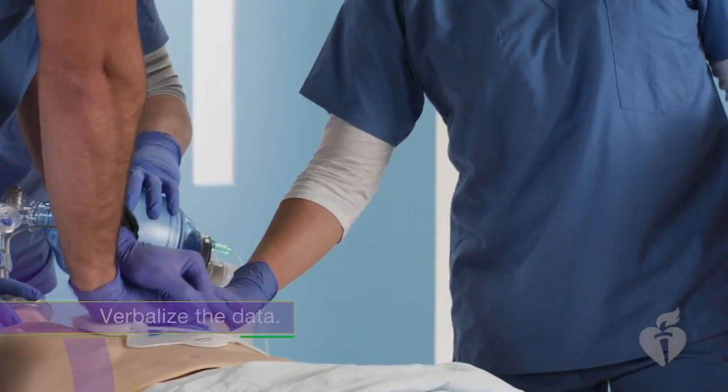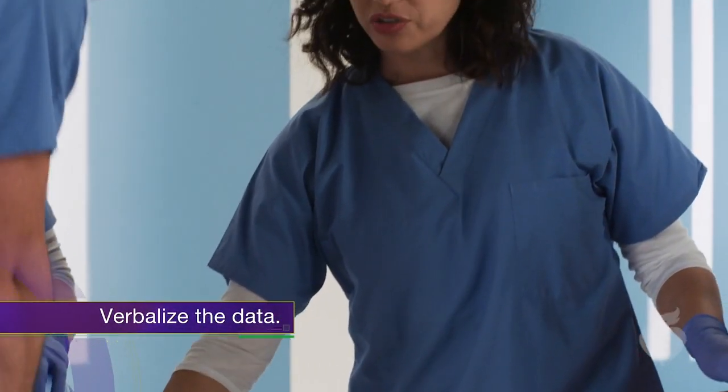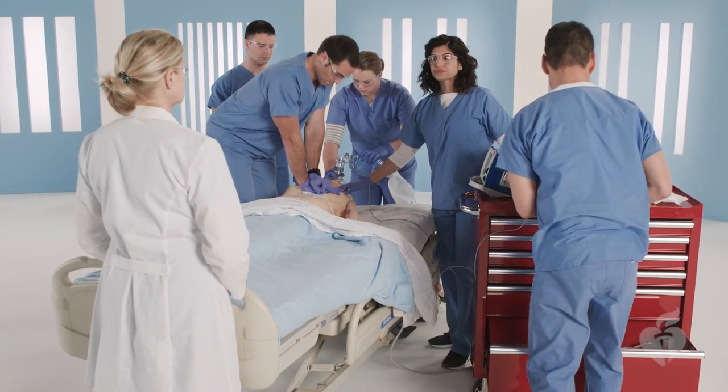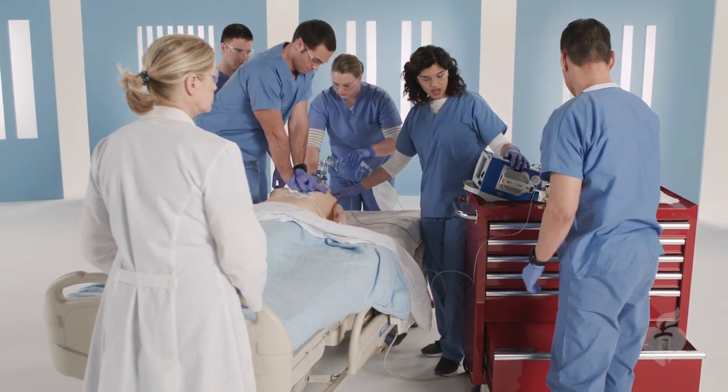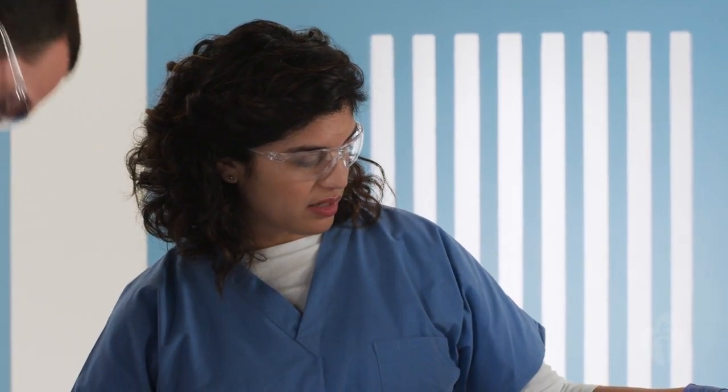Now that the CPR coach is in place, they should verbalize the data from the feedback device, providing corrective and positive feedback, such as "Push harder," or "Your rate is good. Great job. You're right on target."